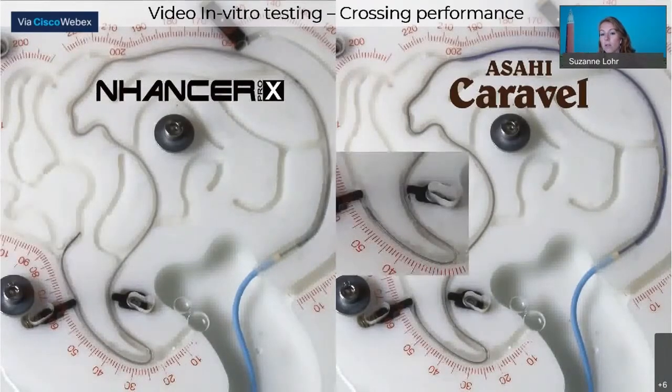But then they have to cross this sharp bend, and then they have to cross an occlusion. And the Enhancer Pro X could cross easily. And for the Caravel, you see that the shaft is backing up completely because it is not able to transfer this force from proximal to the distal tip.